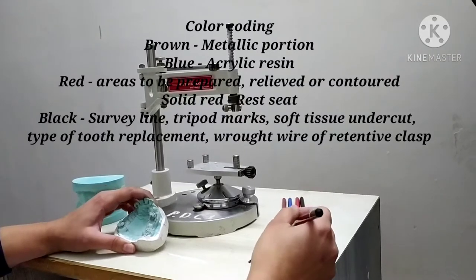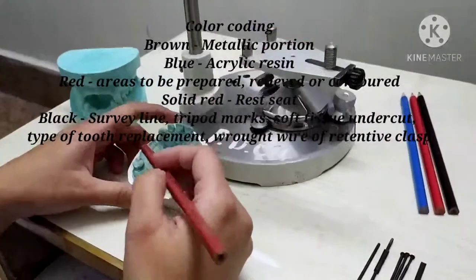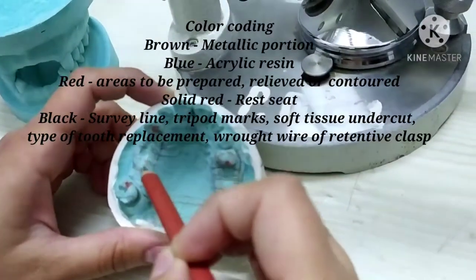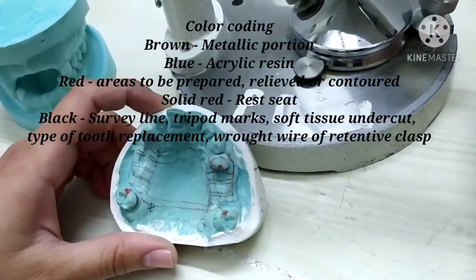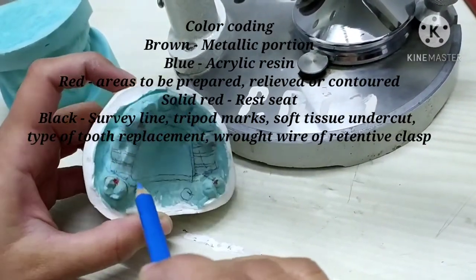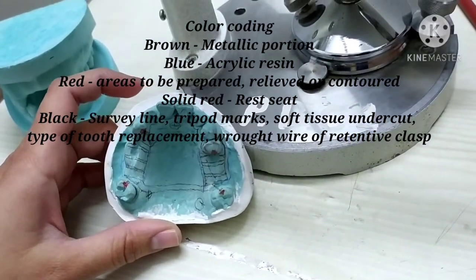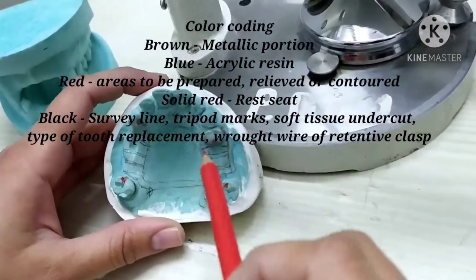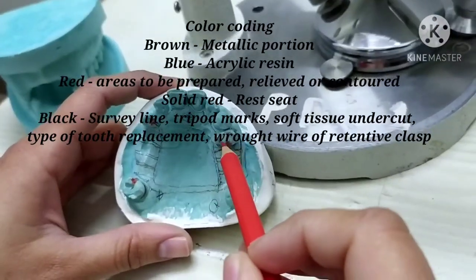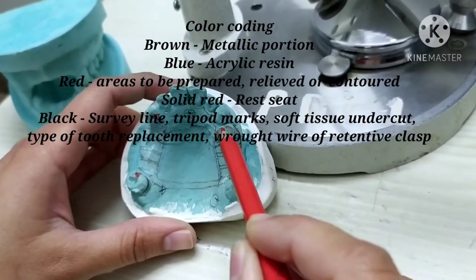First, the brown pencil is used to mark the metallic portions of the denture base. The metallic portion of the framework is marked with the help of the brown pencil. Then, the blue pencil is used to mark the denture base area or the denture base extension where the acrylic portion will be extended. The red color is used to mark any interferences, any relief to be done, or any contouring of the crown or tooth structure.